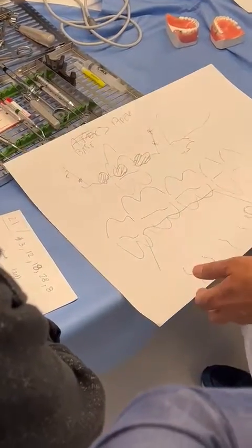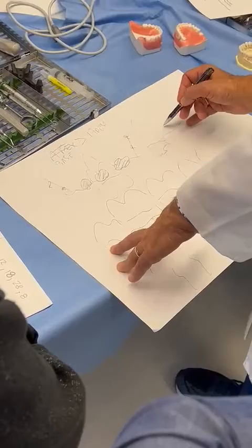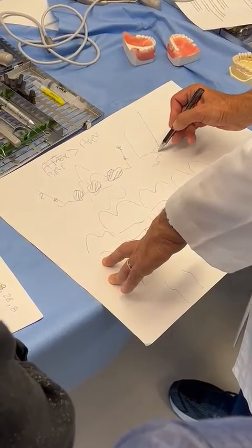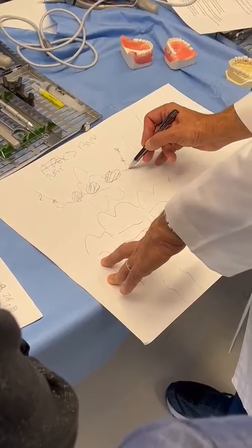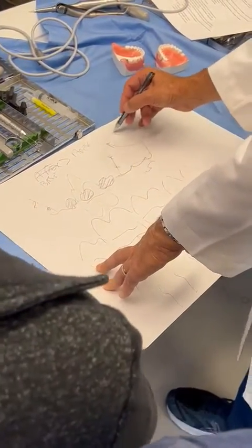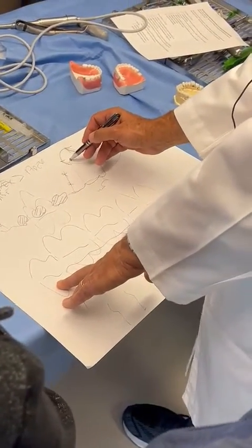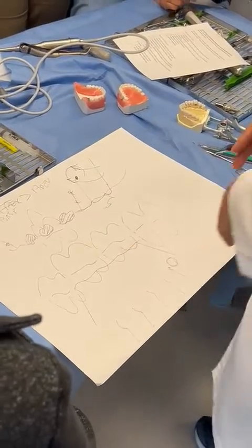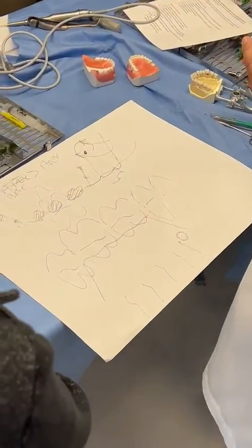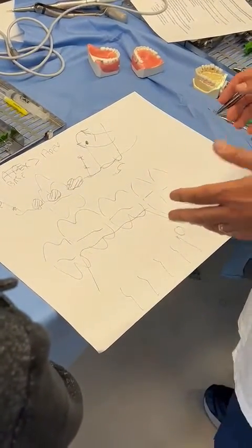Now, in the realm of apical surgery, yeah, you might do a releasing incision because this was a papilla here, right? Like this. And you're going like this, and you're going like this along. You might do one vertical release, and you might open that flap this way to expose the apex to do an apicoectomy, which are pretty historic now in the days of dental implants. So to help you access something that's high up in the apex, I would say you could do a vertical releasing. For impacted wisdom tooth?